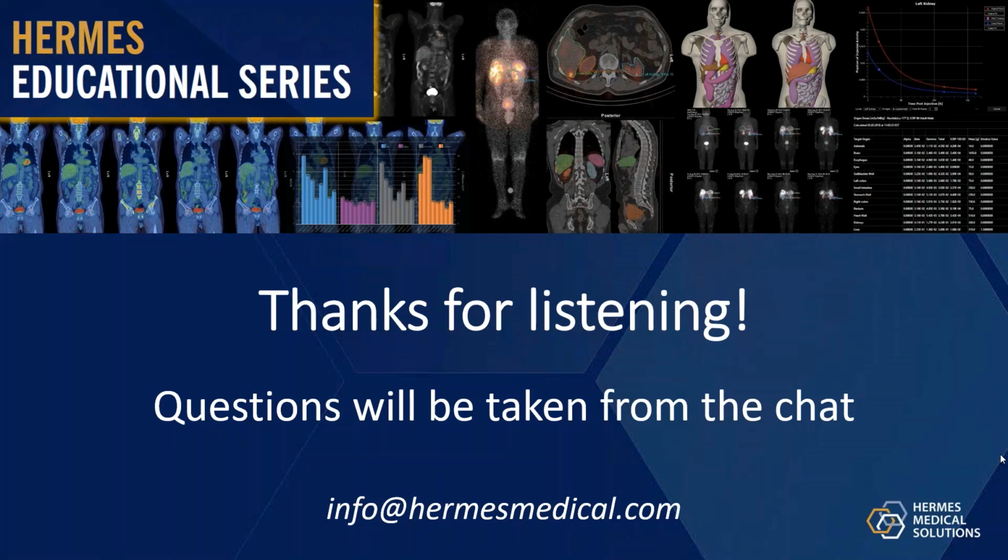Well, how the resolution improvement is generated is that the algorithm will force the activity. For example, in the bone case, it forces the activity to be inside the bone, and that will of course increase the resolution of the SPECT images quite dramatically. But as I said, it probably cannot be used in all occasions, because there has to be some correspondence between the SPECT uptake and how the CT image looks.